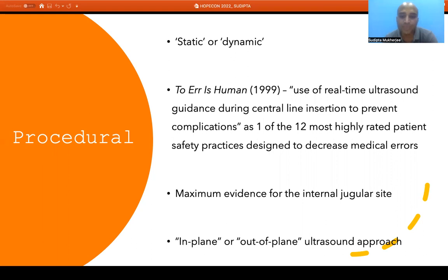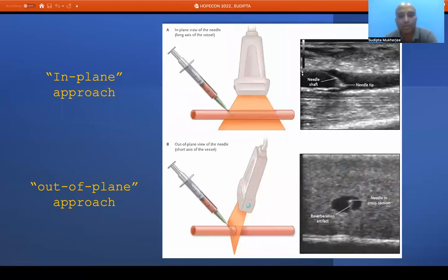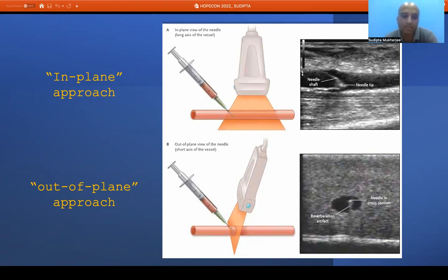With more practice and better skills, we can apply similar concepts to pediatric patients and subclavian vein. There are two approaches: in-plane, where the entire needle length remains within the ultrasound beam allowing continuous tracking; and out-of-plane, where the needle axis is perpendicular to the ultrasound waves, so the beam cuts the needle at a certain point — the tip or shaft — appearing as a hyperechoic dot with reverberation artifacts. The out-of-plane approach has a higher chance of complication but requires less skill.